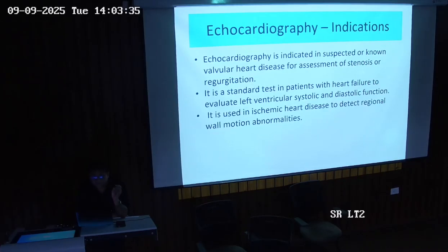It is a standard test in patients with heart failure to evaluate left ventricular functioning. So if we want to know the left ventricular functioning in a suspected case of heart failure, echo is the diagnostic choice. It covers the systolic and diastolic functional assessment.